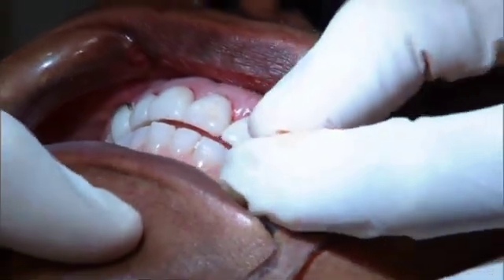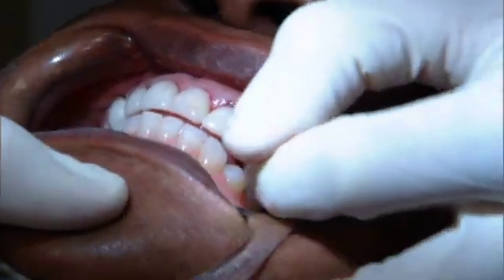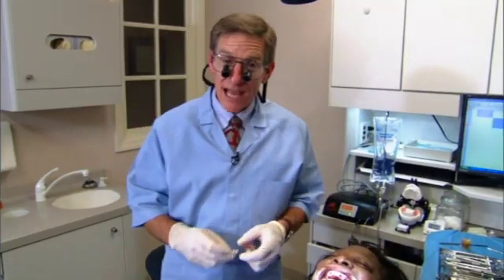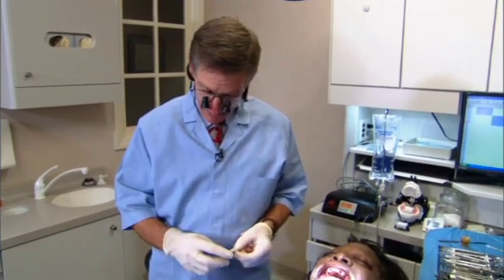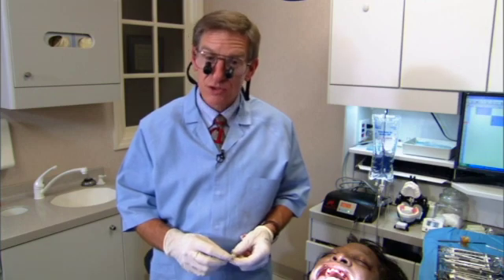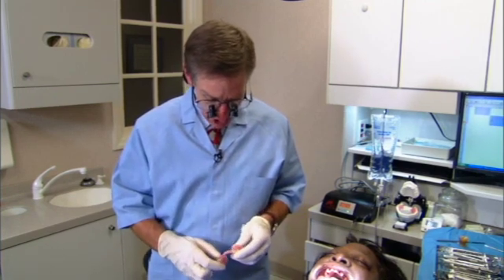Atta girl. Yeah, I'm going to need to adjust this side a good bit. Okay. We have gone to the lab and we've trimmed Beverly's provisional. It really didn't take that long because I was able to take most of it off with an Explorer. I wanted to make sure that the margins were nice and polished. I also made a few adjustments to her temporary partial.